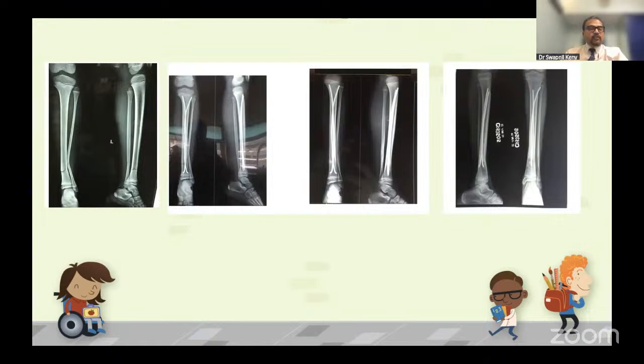So essentially, again, if you look at this X-ray, I am not really following the elastic principles. But if you look at the spindle, the center of the spindle is in the medullary canal. Two nails are very well fitting. And most important is that there is a good distal metaphyseal fit. So this fracture is stable because of the proximal forces of the spindle, which is keeping the proximal fragment in position, and a good metaphyseal fit in the distal fragment of two nails, which are inserted from diametrically opposite points, which are equal in diameter, but the two distal ends of the nails are going in a divergent fashion, and that is what is leading the reduction. And you can see there is no valgus at the fracture site eventually.